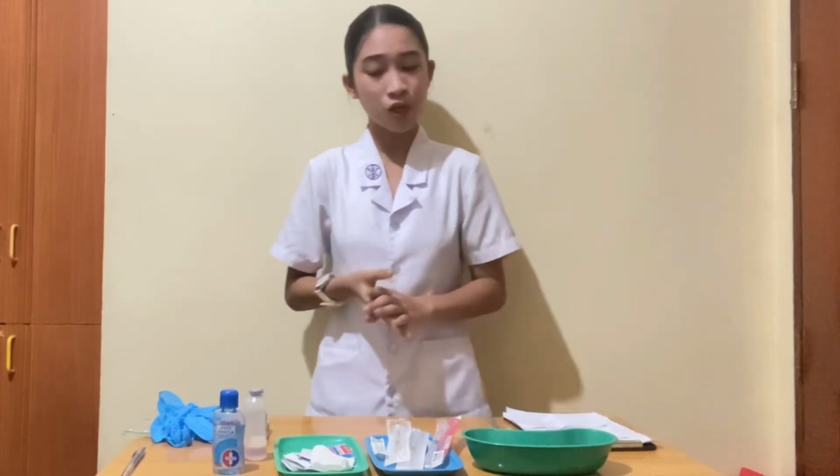Now remember to follow the 3 checks for administering medications. We need to read the label on the medication when it is taken from the cart, before withdrawing the medication, and after withdrawing the medication. This is done to systematically verify and ensure the accuracy of medication selection and dosage, thereby minimizing the risk of errors and prioritizing patient safety.